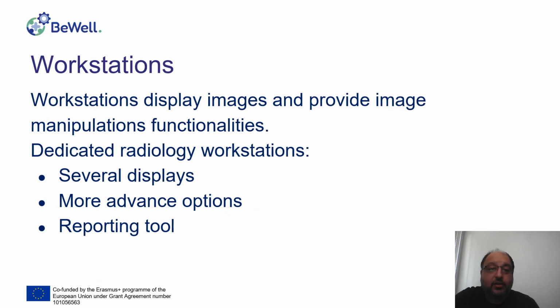The workstations, there are several types. They display images and provide image manipulation facilities. And as already explained, manipulation does not mean some bad thing in this case, but just processing of the image to enlarge or to rotate or whatever. There are dedicated radiologists' workstations with many capabilities. They have several displays, usually two or three displays.